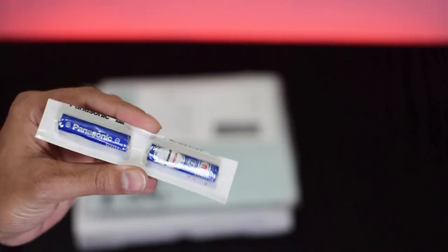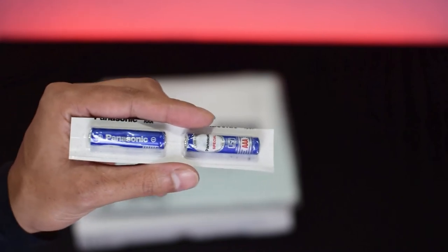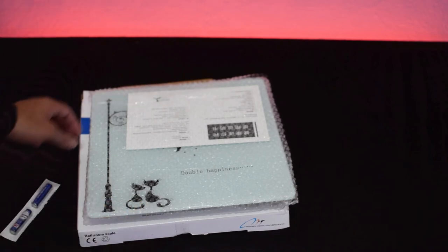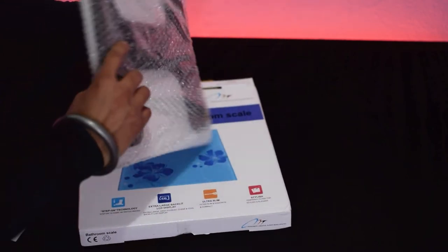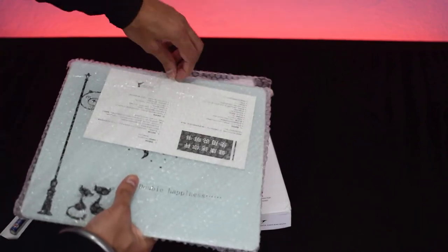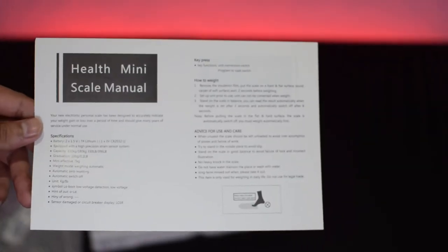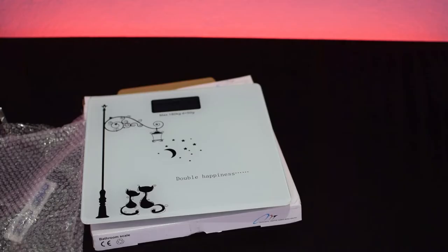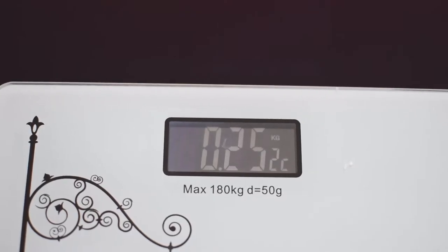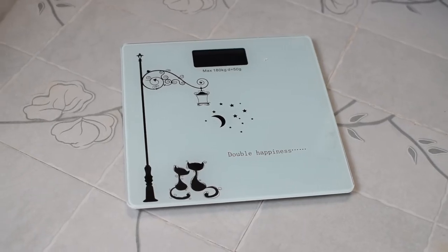We get two triple-A batteries that are used to power up this scale. The scale is wrapped in bubble wrap which will protect it during shipping, which is a good option. We also get the scale manual where all the specifications and other information are printed. Here is the scale with an extra-large backlit LCD display with a stylish and elegant tempered glass top.